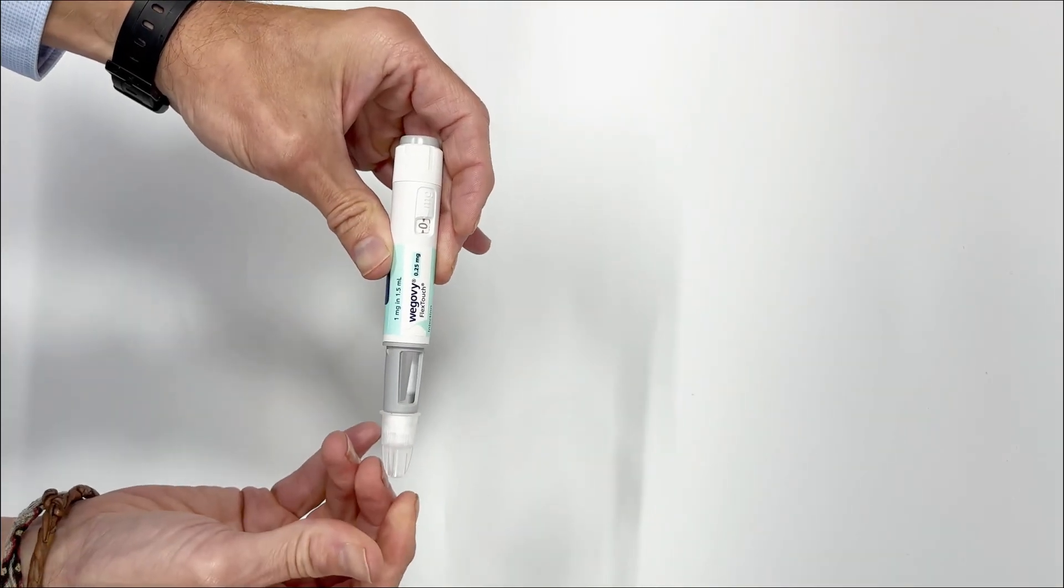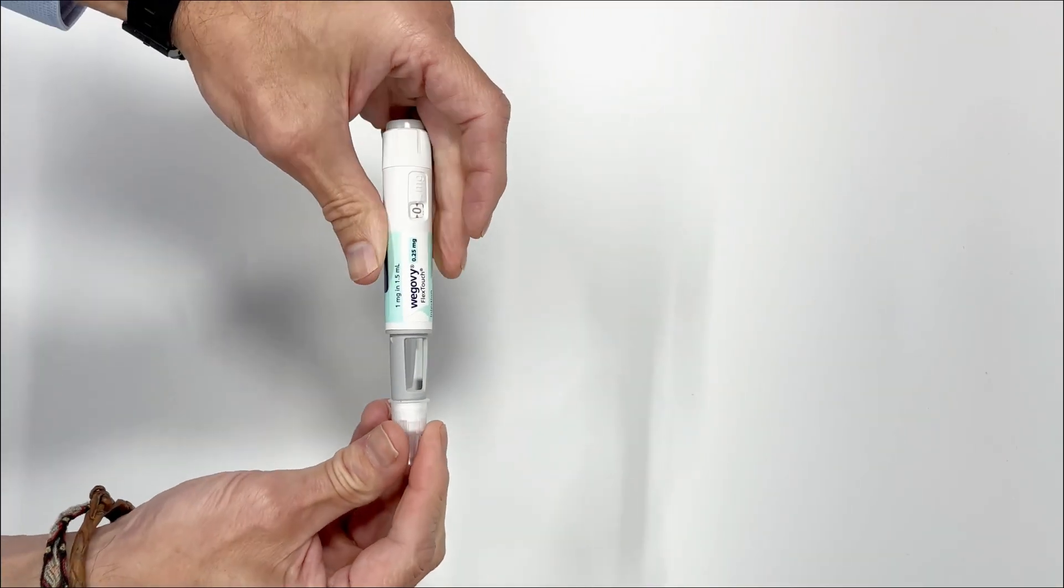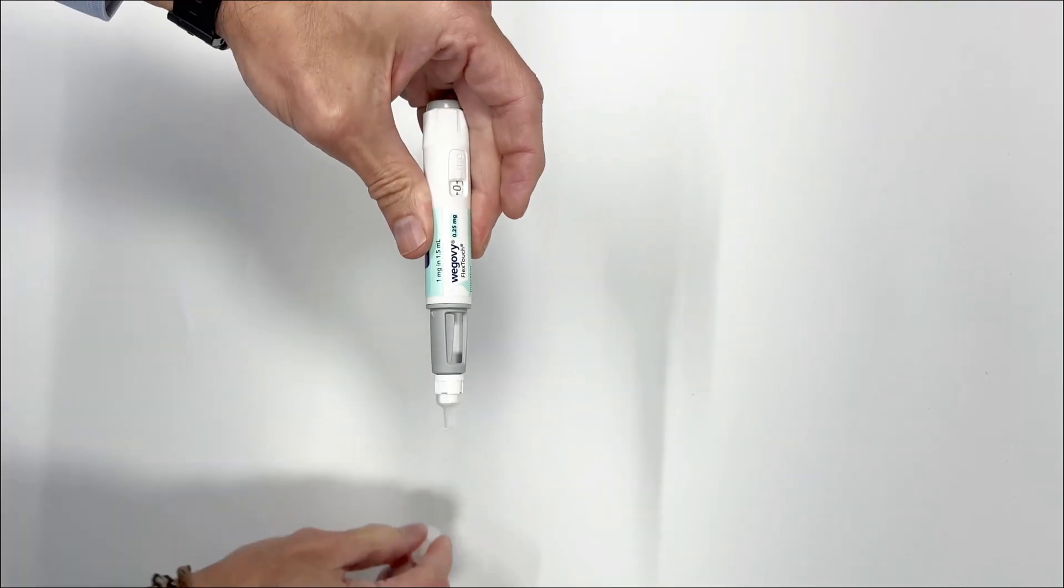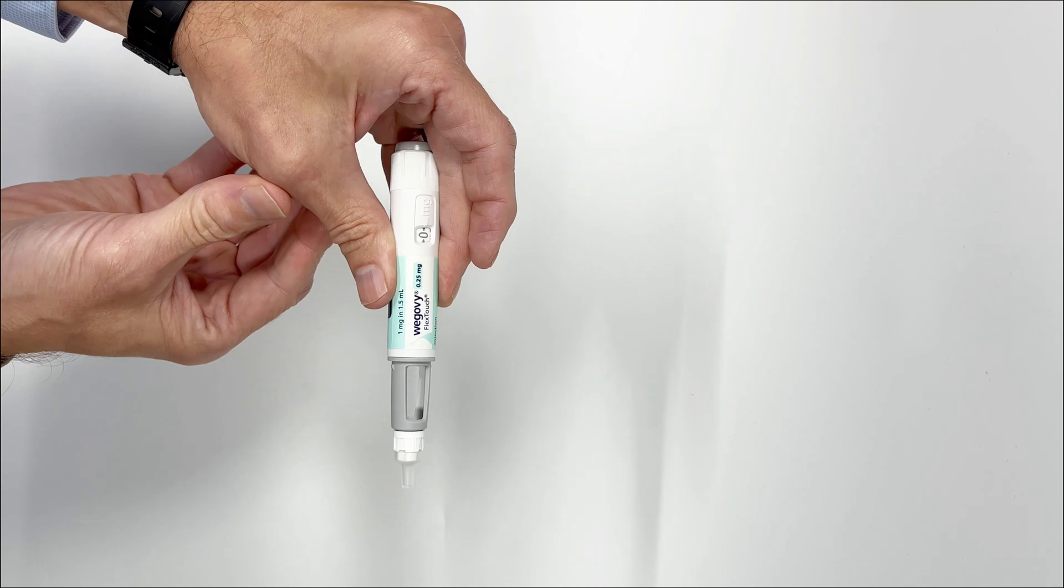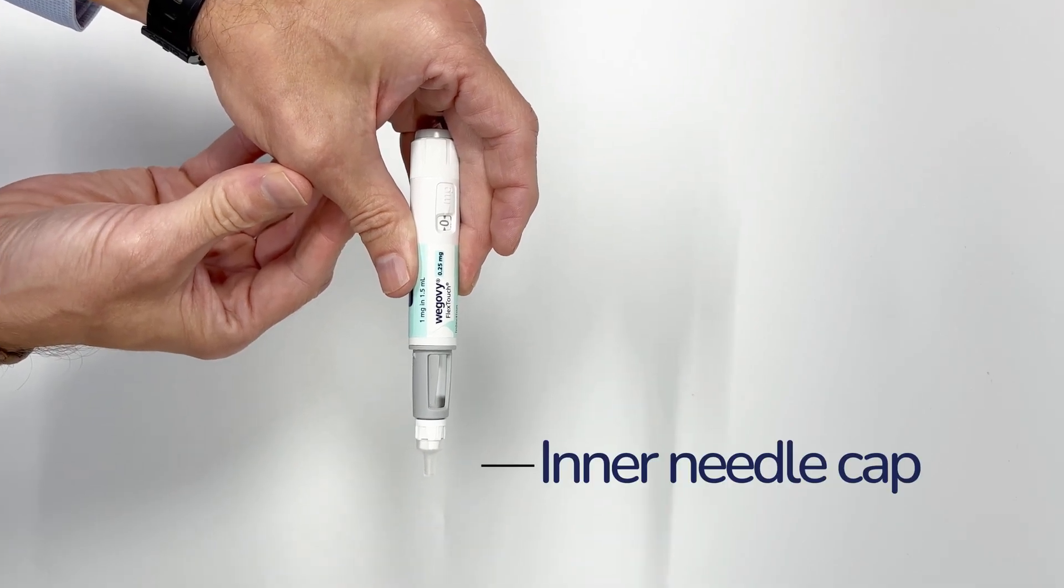Pull off the outer needle cap and save this for later. You'll need it to safely remove the needle from the pen after injection. Inside you'll see a smaller inner needle cap covering the needle. Pull off the inner needle cap and discard it.